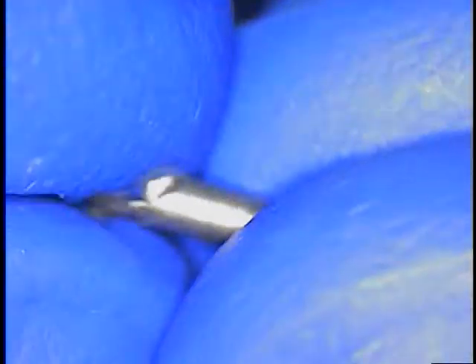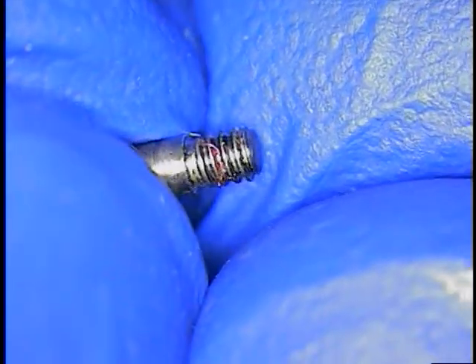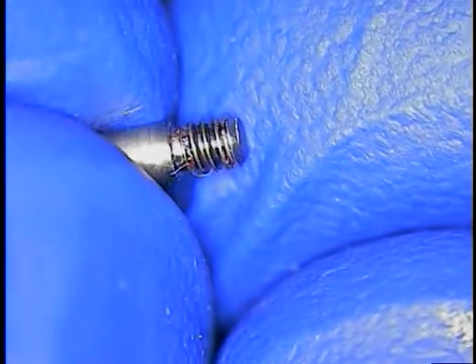And let's check to see if there's any bioburden inside that screw. There it goes. So we took the head of that screw off, and yes, there is a lot of blood in there, a lot of bioburden. That's the first thing I checked for. So we got to go ahead and clean the threads out.